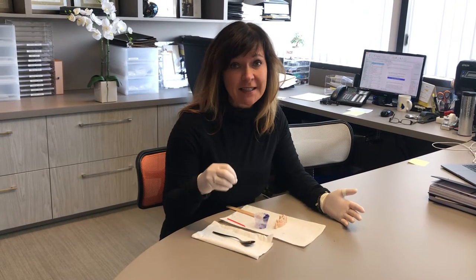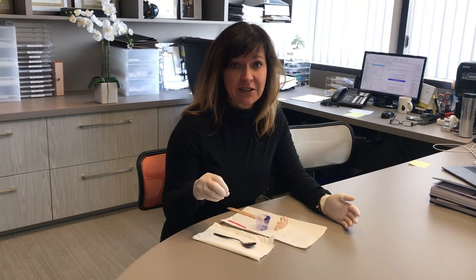Hi, I'm Dr. Agatha Biss. If any of you have lost a crown in this time of crisis during COVID and you can't get in to see your dentist, I want to give you a couple of tips you can do at home to put your crown back on at least temporarily until you can get into the office.